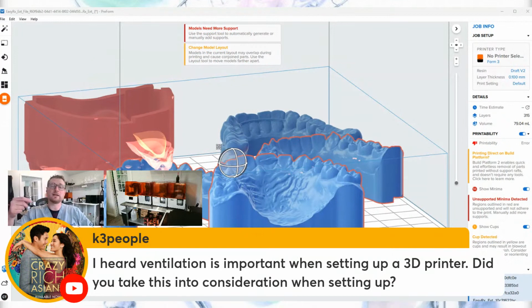So, eventually, yeah. But with the Formlabs, I've never had a ventilation issue. I've had a friend that used SprintRay. She's an in-house lab tech, and the fumes were actually causing her to break out. And so they had to do ventilation. They had to put the printer in another room. Not saying anything against SprintRay, just I believe it has to do with the resins. Formlabs, their resins aren't as volatile. It prints slower, but it's not as volatile.